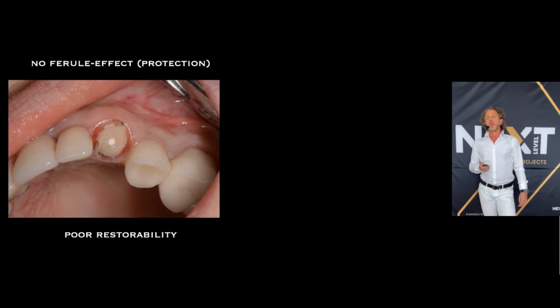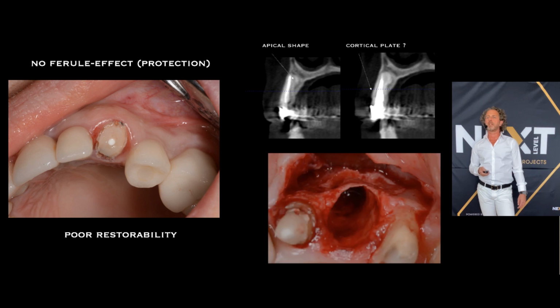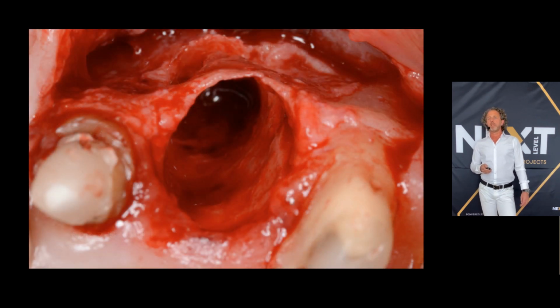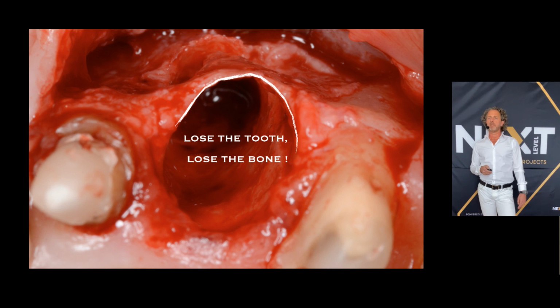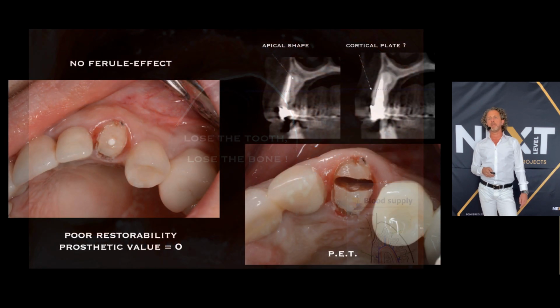And this was the hopeless canine. On the CBCT we checked, there was a strange apical formation and a very thin and fragile cortical plate. This image shows another case just to make you visualize how thin that cortical plate is. So now we understand if we lose the tooth, we definitely will lose the bone. Why? Because of the blood supply.